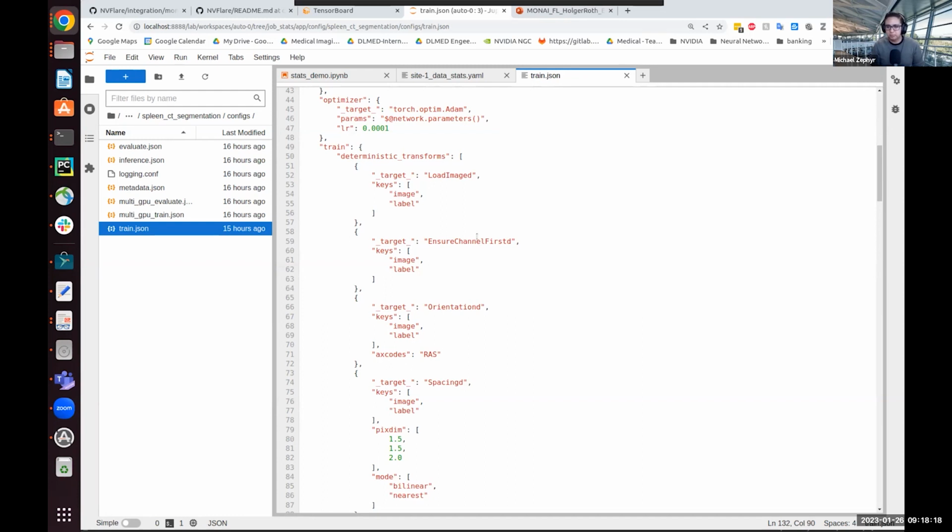I know we've been experimenting with integrating 3D Slicer into a notebook, so you can execute a cell, and it'll actually load the data from Slicer and have a little mini Slicer client in the Jupyter notebook, running on a VNC client behind the scenes in another Docker container, but it displays in the notebook itself. So that can integrate into your workflow. I think there are a lot of different ways to go about that, but I'll let anyone else chime in if they have any suggestions or ones that they use.